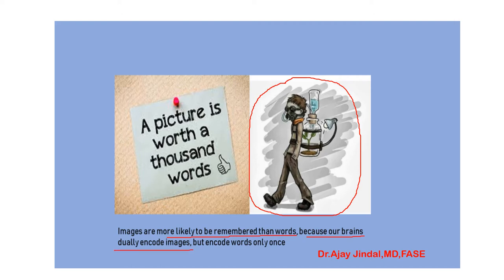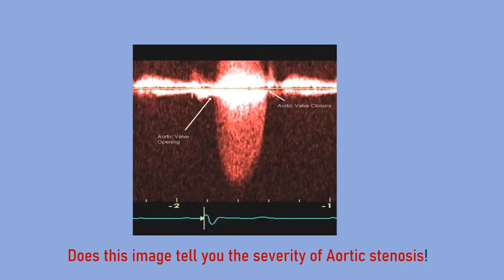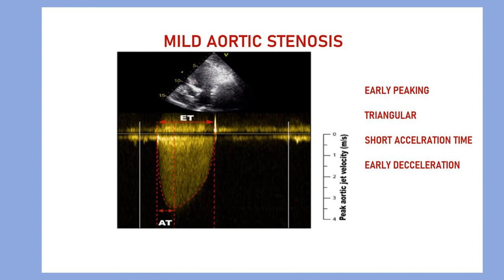We will start from the Doppler signals of the aortic valve. This is the continuous wave Doppler signal of the aortic valve — this is the aortic valve opening, this is the aortic valve closing, and this is the Doppler signal of the aortic valve. Now we will start with mild aortic stenosis.